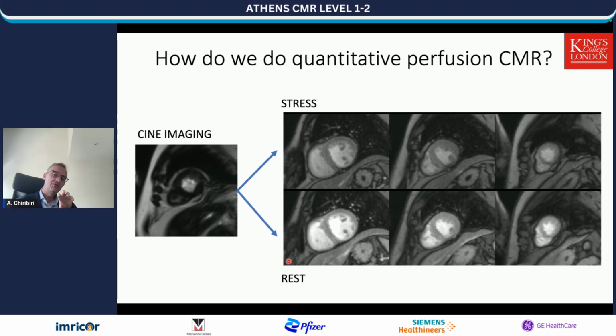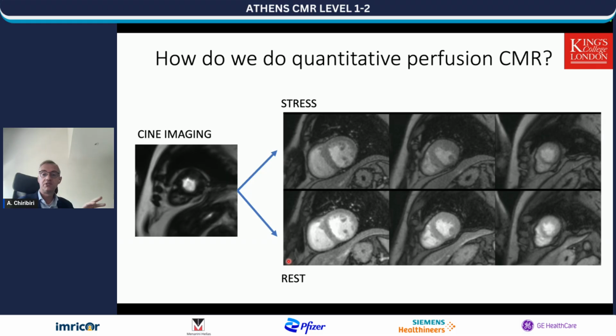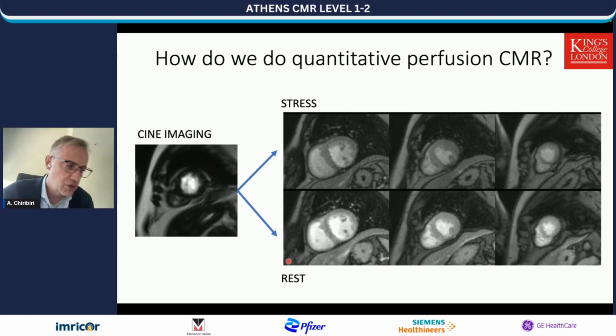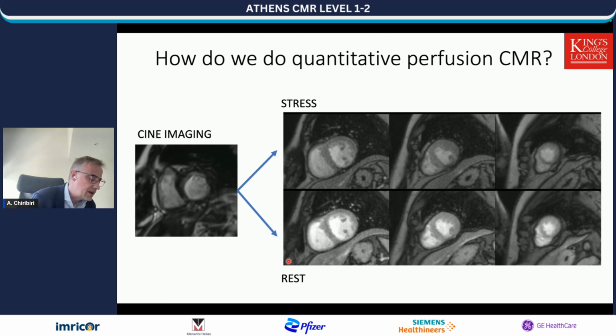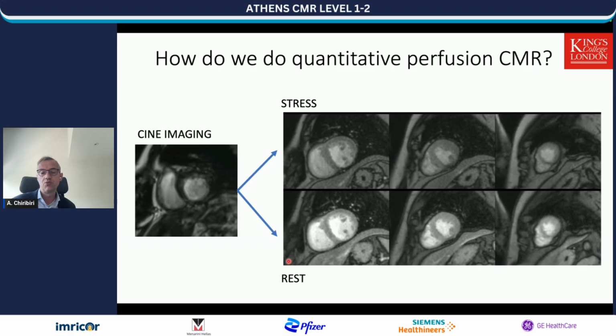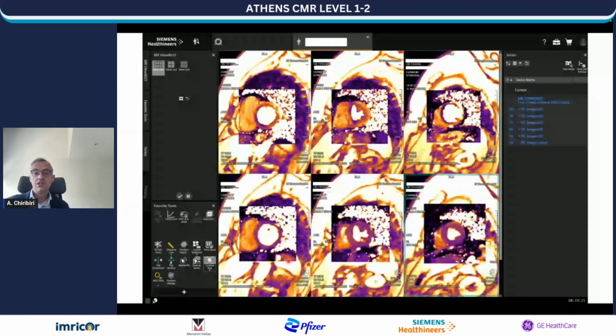And therefore, that allows a pixel-wise mapping without any motion being included in the maps, which is instead something which is still affecting T1 mapping, where due to the inversion recovery pulse used for the acquisition of MOLLI sequences, if there is any respiratory motion in there, it's much more complex to motion correct. Instead, we now master this in perfusion. And then less than 90 seconds after the acquisition of the images is over, and this is an example on our Siemens scanners, you get the quantitative maps directly calculated on the system and displayed on the scanning interface.